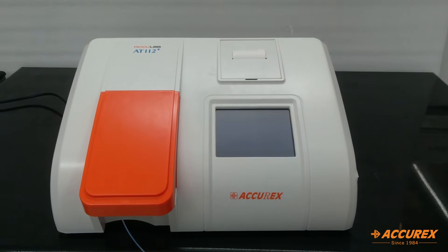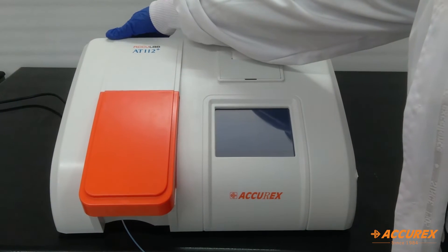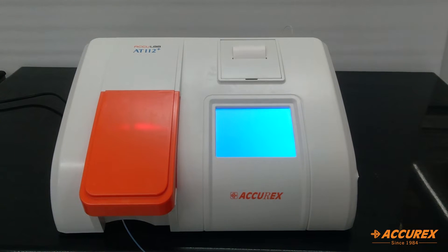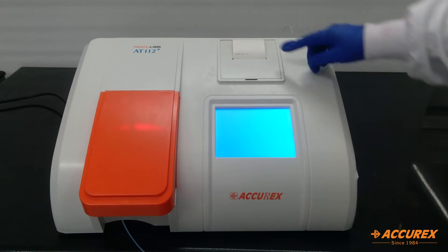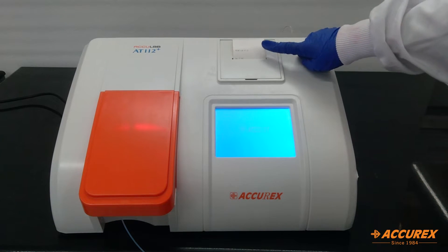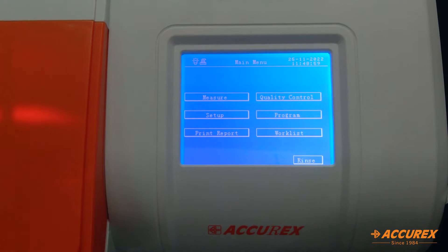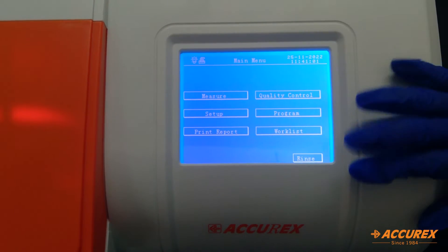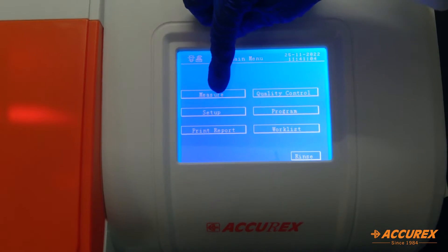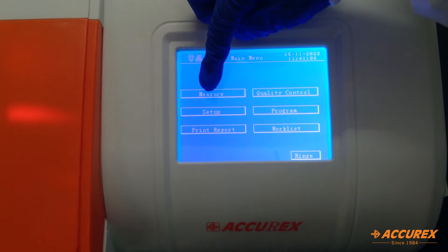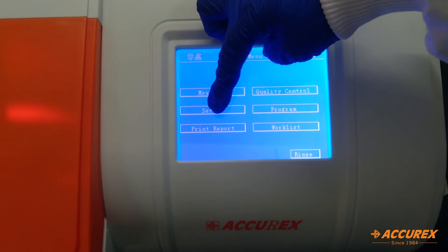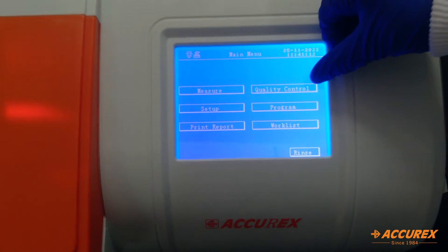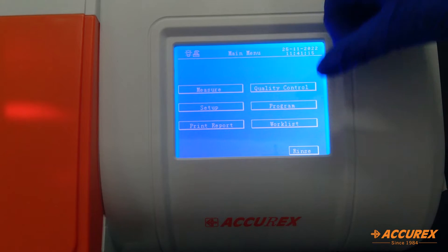Now we will switch on the analyzer and see all the features of this analyzer. So when we switch on this analyzer, the printer will check and it will print 'print okay'. Here there are various options given. The first one is measure from where you can test all the programs. Second one is setup. Third is print report. Fourth is quality control, program, and work list.